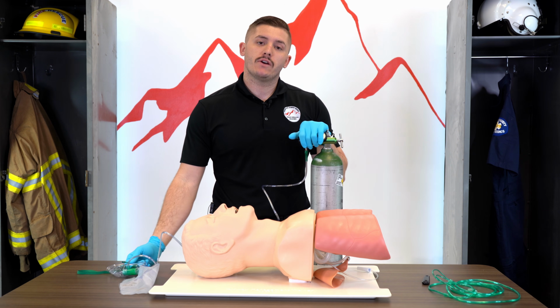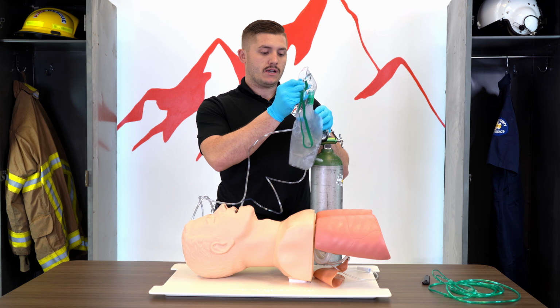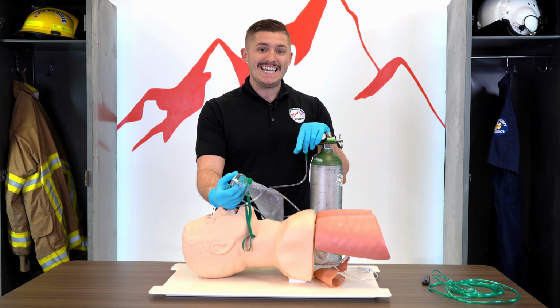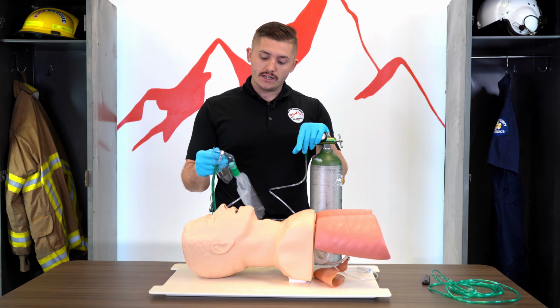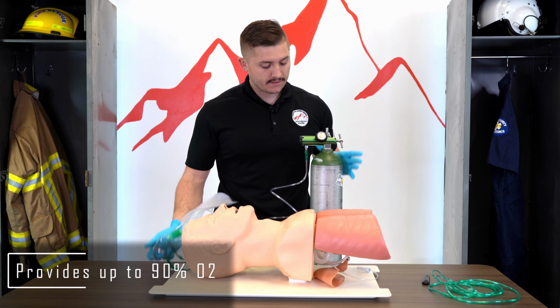And we really want to be aggressive with non-rebreather. Typically in the field, we throw on a non-rebreather when we think our patient is what's called circling the drain, or we might be having to intubate this patient. We like to pre-oxygenate them with a non-rebreather because this has a lot of oxygen in it. So with the non-rebreather, we're going to flow this at 10 to 15 liters per minute.